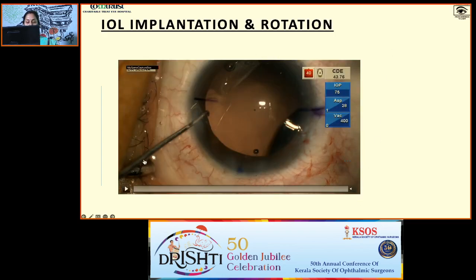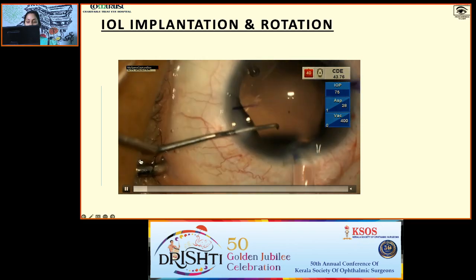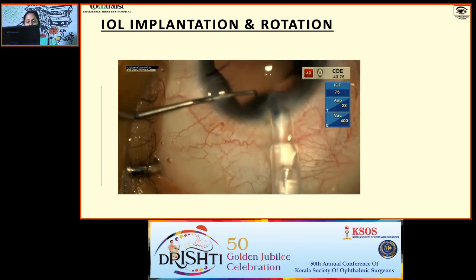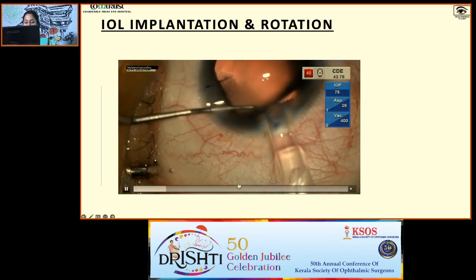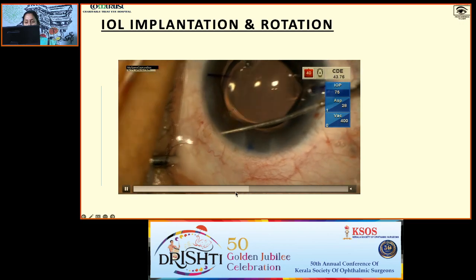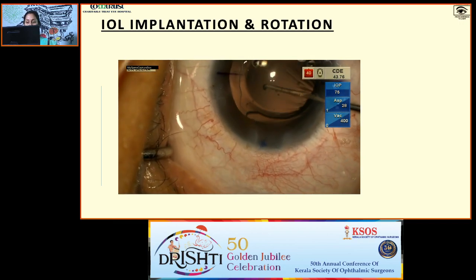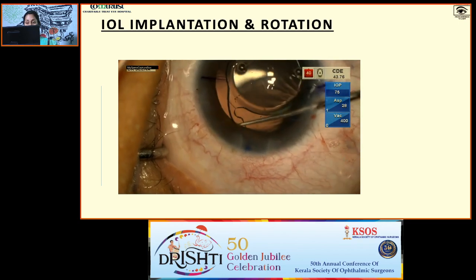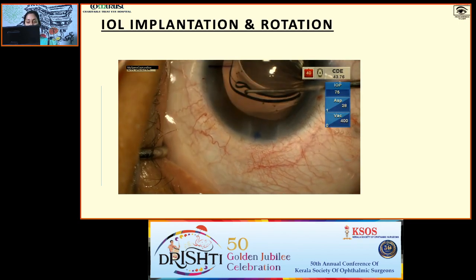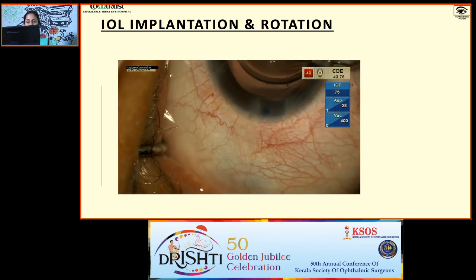For implantation, you can either proceed with a wound-assisted implantation or normal implantation. Once it is there inside the AC, the front haptic has to be inside the bag. The back haptic, that is the trailing haptic, has to be folded and kept inside the AC. Once it is inside the bag, you can rotate it at the optic haptic junction with your dialer to the desired axis.